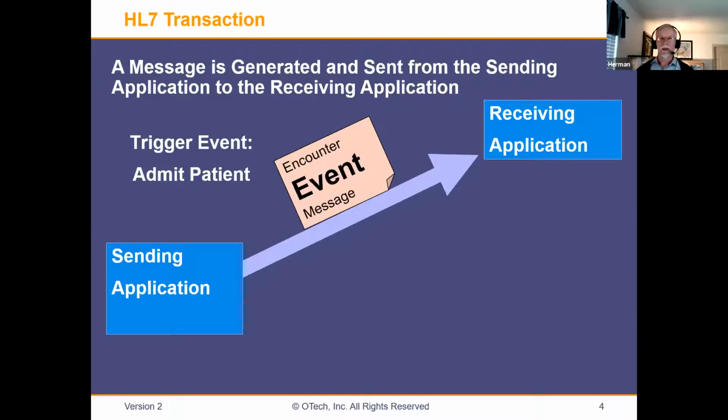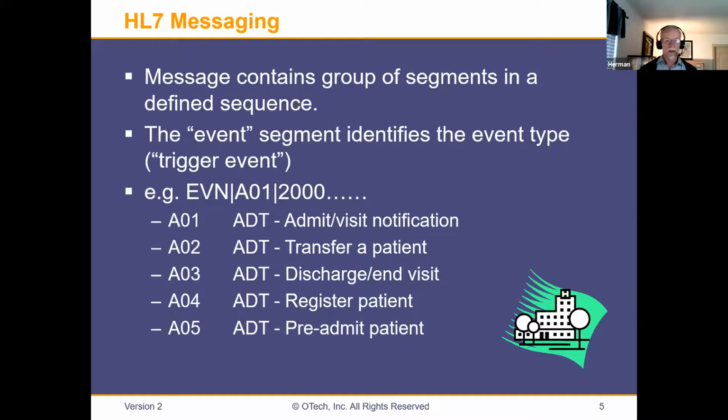So what is critical in these HL7 messages is the event type, the event code, because each event has a 3-character code. For example, A04 is the code in the first line of the HL7 message that says, here's a bunch of patient information, and that means that this patient has to be registered, or this patient has arrived. That's actually an important one that we sometimes look for in our modality worklist provider too. Let's say we have scheduled a patient, and we probably know there are always no shows, or people that cancel, or people come late.